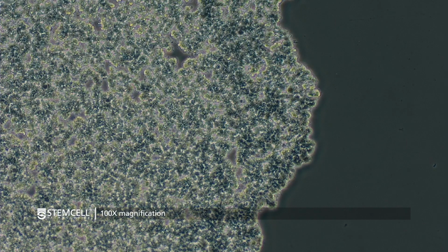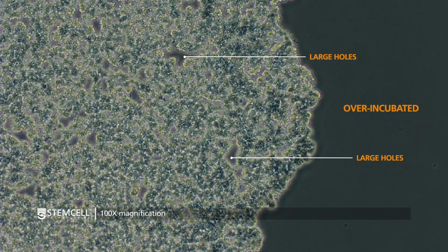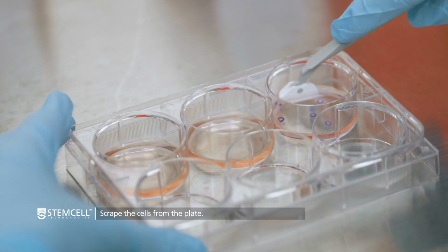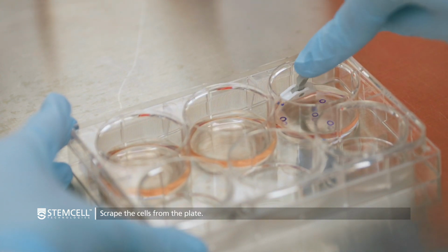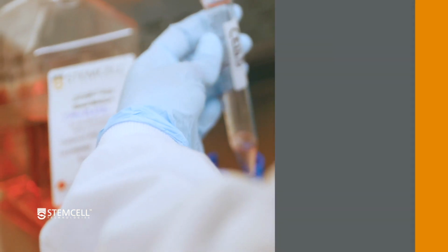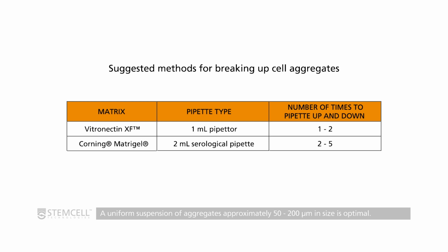If the culture is over-incubated, large holes will be evident, and upon scraping, many single cells will be generated rather than aggregates. Aspirate the GCDR and add 1 milliliter of mTeSR1 or mTeSR Plus to the well. Using a cell scraper, scrape the cells from the plate, ensuring not to splash the medium from the well. Now, transfer the detached cell aggregates from the well to a 15 milliliter conical tube using a 5 milliliter serological pipette. Then, carefully pipette the aggregate mixture up and down to break up the aggregates as needed. A uniform suspension of aggregates approximately 50 to 200 micrometers in size is optimal.